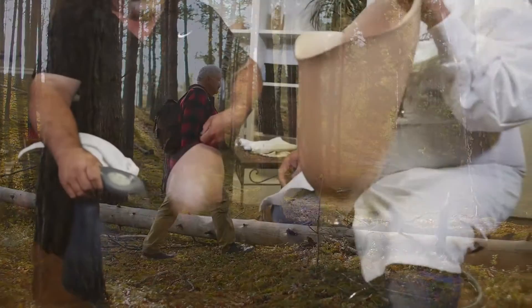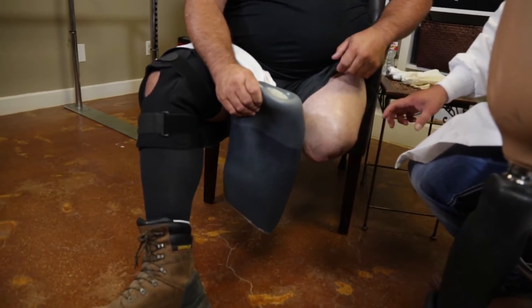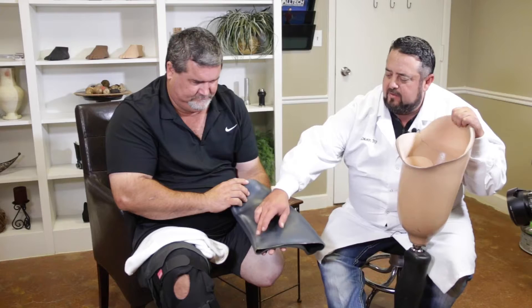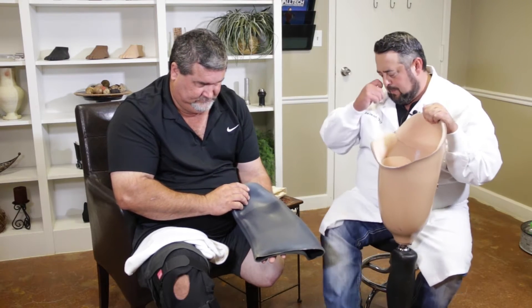We're going to watch this real close. This is a silicone roll-up liner. Basically what we're going to do is the patient has this cut down to a particular size — it's shorter in the groin area than it is on the outside — so when he goes to put it on he's going to roll it up with this to the inside, this to the outside, so he's got the lanyard cord on the bottom.